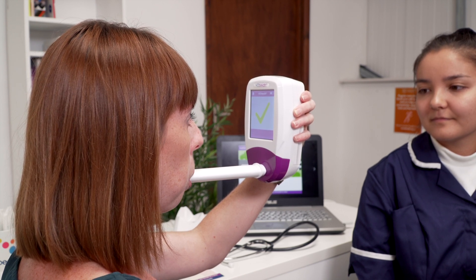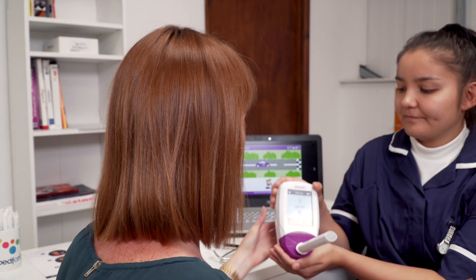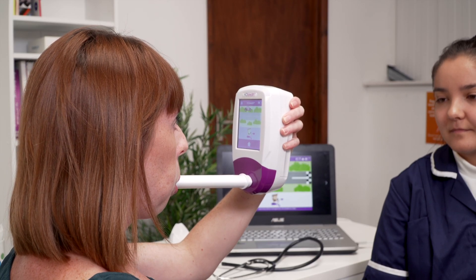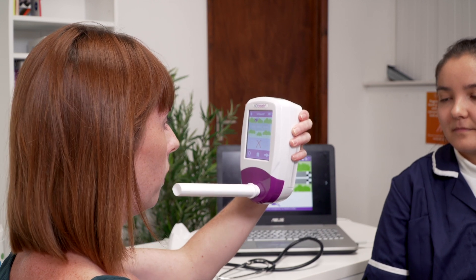Continue blowing until the green tick appears on screen to signify a successful test. If you blow outside of the exhalation guidelines, the test will beep signifying a fail and a red cross will appear.